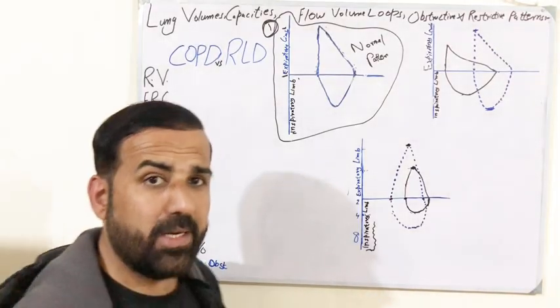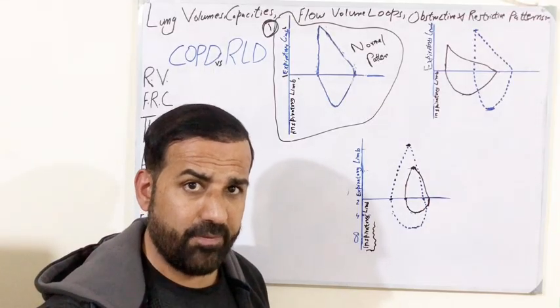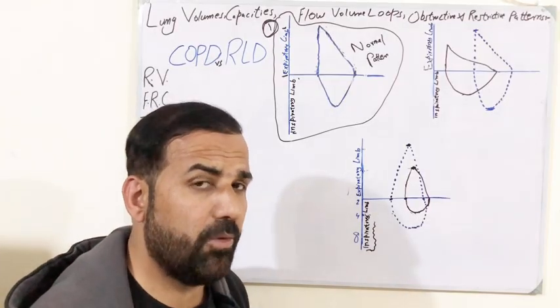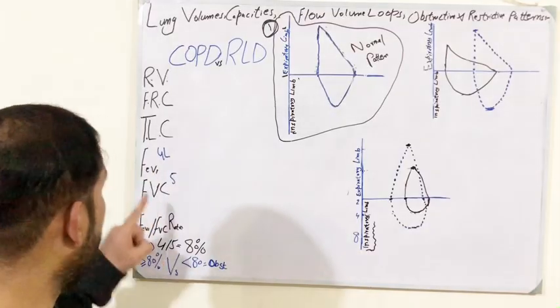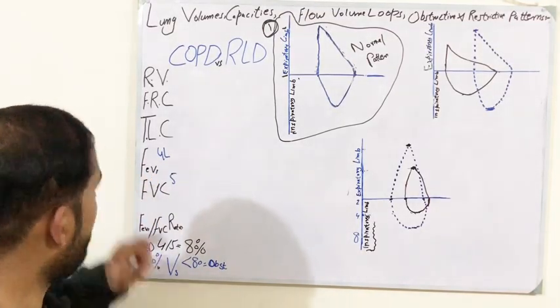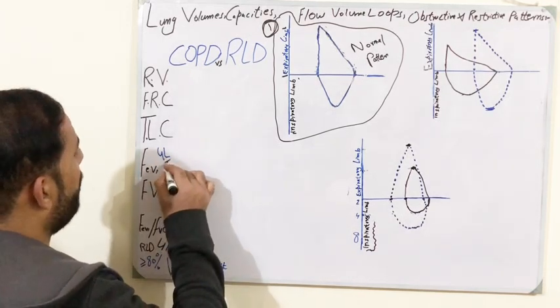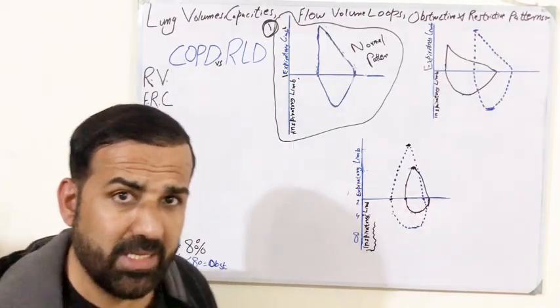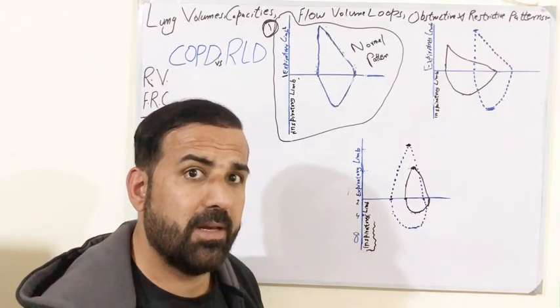Now let's define what FEV1, or forced expiratory volume in the first second, is. If spirometry records your expiration in the very first second, the amount of air expired in the first second is called FEV1, right? As an example, we can suppose FEV1 is 4 liters. It means that this patient's forced expiratory volume in the very first second was 4 liters.